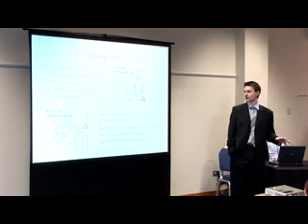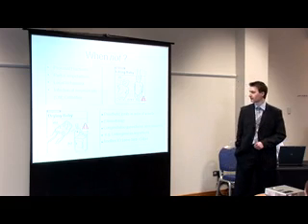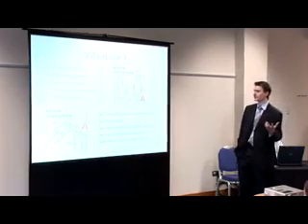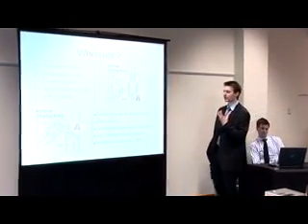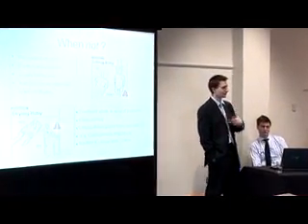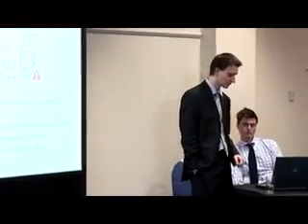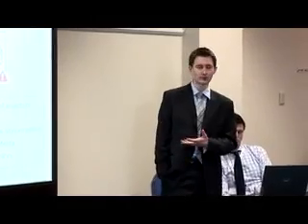One of the access devices, which we'll talk very briefly about, is called the FAST-1, which is a sternal access device. Don't use that if they've had a sternotomy and they've got wires holding their sternum together. Often people who've had bypass grafts, their sternums don't actually unite fully, so you wouldn't put it in there, obviously. And anyone who's got congenital or acquired bone abnormality. So if they've got brittle bones, osteogenesis imperfecta, then don't put it in.